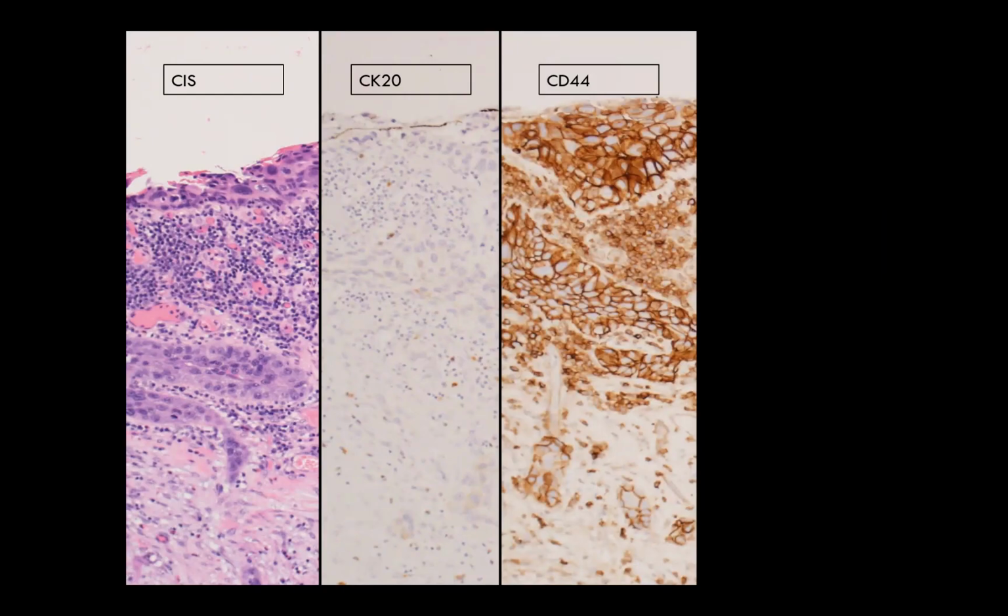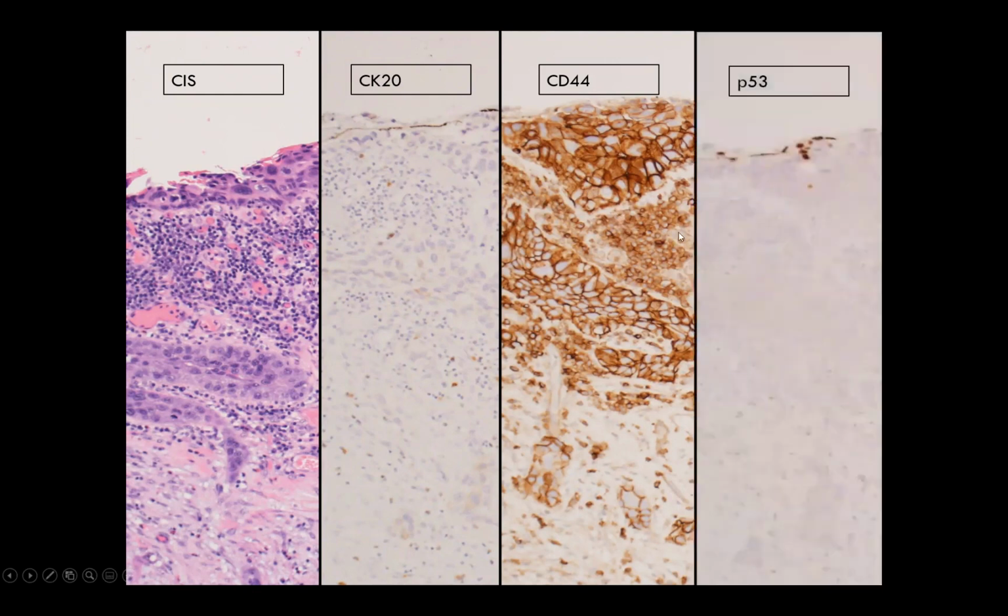So these stains have to be used very judiciously. They have to be used in combination with your morphological impression and not in isolation at all, because this is an absolutely opposite pattern of what we would expect in a carcinoma in situ. And to top it, we have P53, which actually stains a few cells almost like a wild type pattern. Right. So this is not what you expect in a carcinoma in situ. This is a pattern that you expect in a reactive condition. So it can be very misleading.